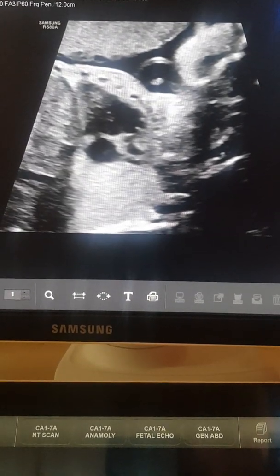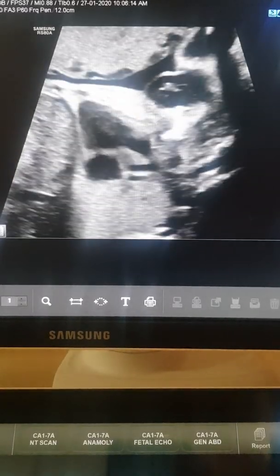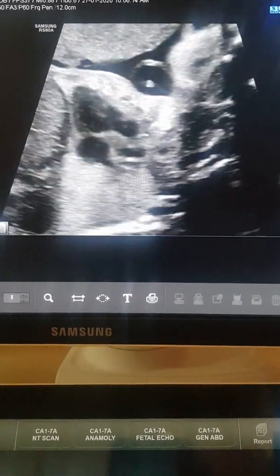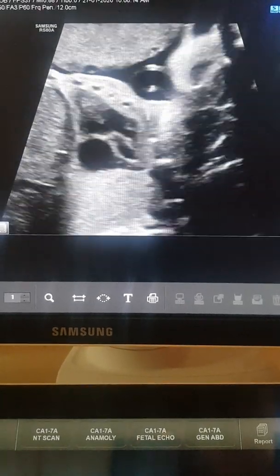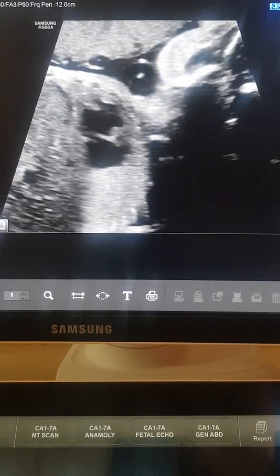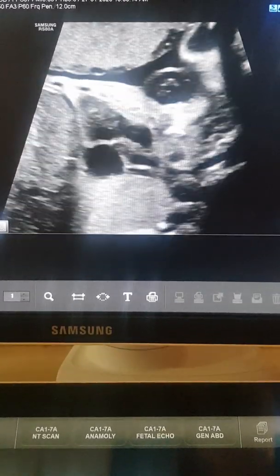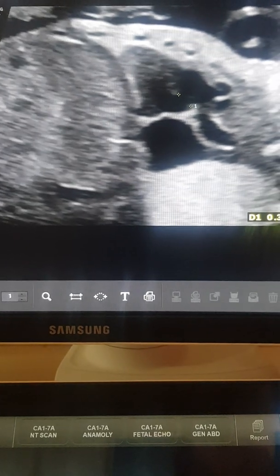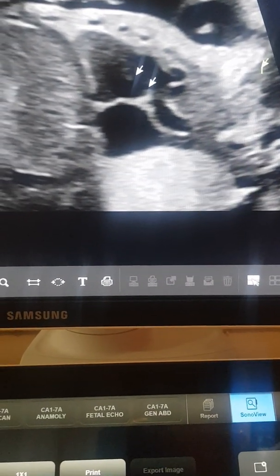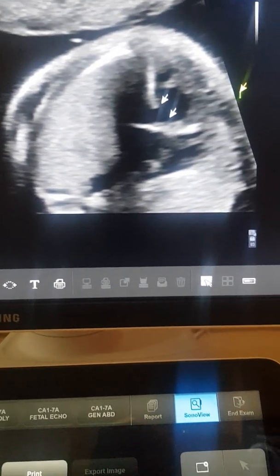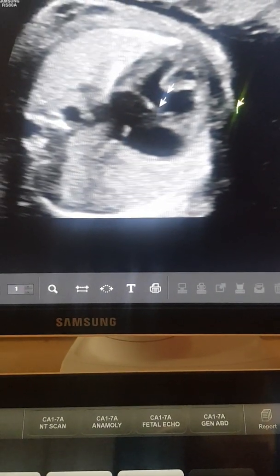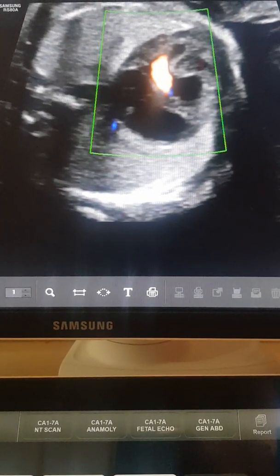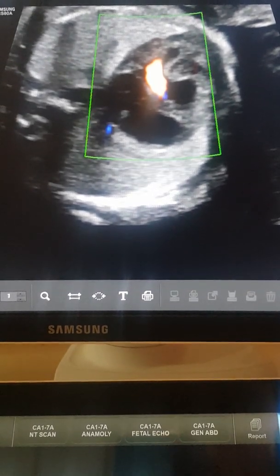Trying to demonstrate continuity of the interventricular septum with the ascending aorta, there is something missing which at this point I could not understand. I thought the VSD was so large that the ascending aorta was completely cut off from the left ventricle in the LVOT view. I decided to wait for more views. The ventricular septal defect measured about 3.6 mm, and after becoming more confident, I demonstrated it in multiple views as a large VSD in the membranous interventricular septum.